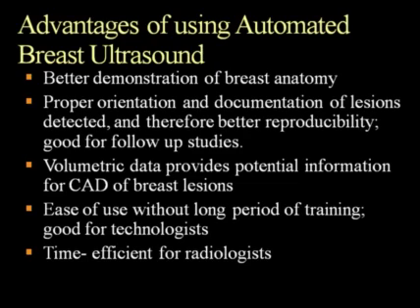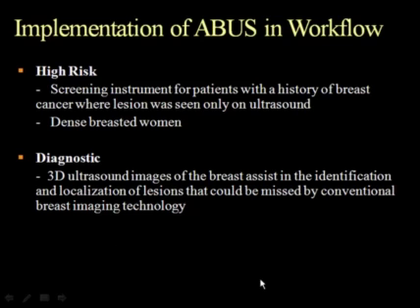You're also getting volumetric data, which potentially has a lot of information there when you're thinking about computer-aided detection of breast lesions down the line. And also, it's easy for our technologists to use, and you don't need long periods of training. It's time efficient for the radiologist.